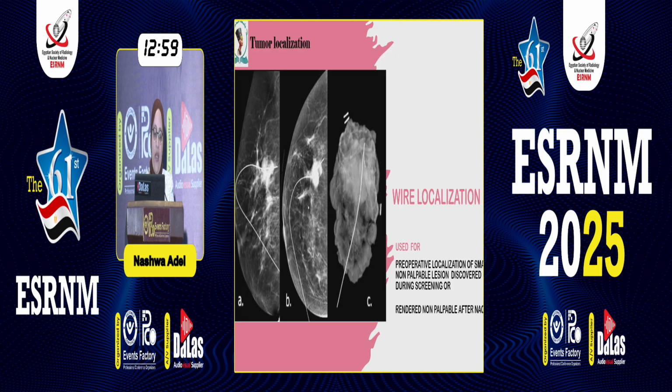Here is wire localization, with the wire's distal end seen in the lesion, and the other end seen outside the skin. And the surgical specimen shows the wire inside the lesion. It is done preoperatively for localization of small non-palpable lesions discovered during screening or rendered non-palpable after neoadjuvant chemotherapy.